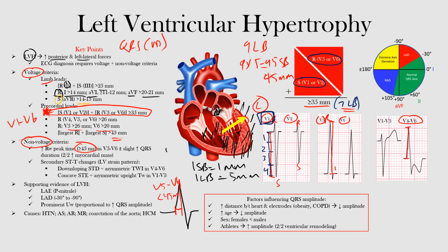Some suggest that this has been going out of fashion and no longer using this term. But I put that there. So usually now they use the secondary ST-T wave changes.